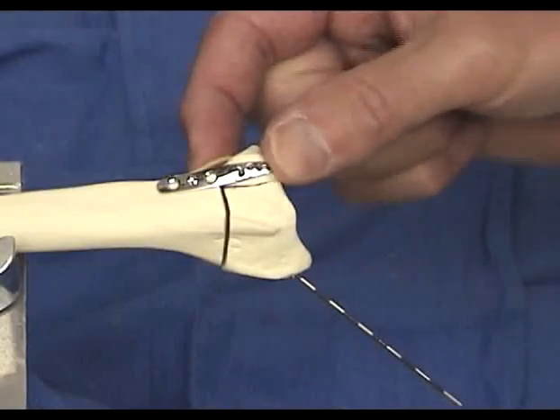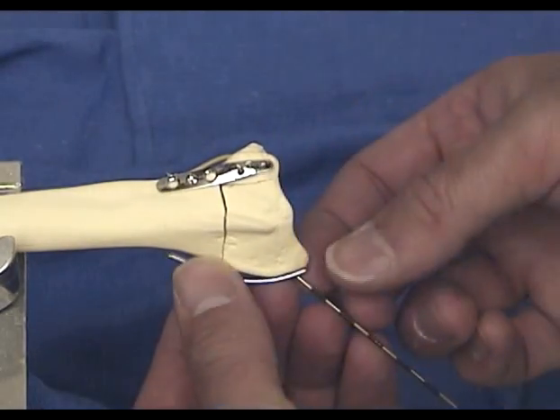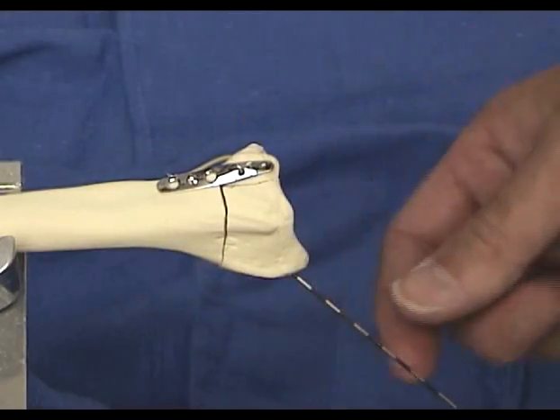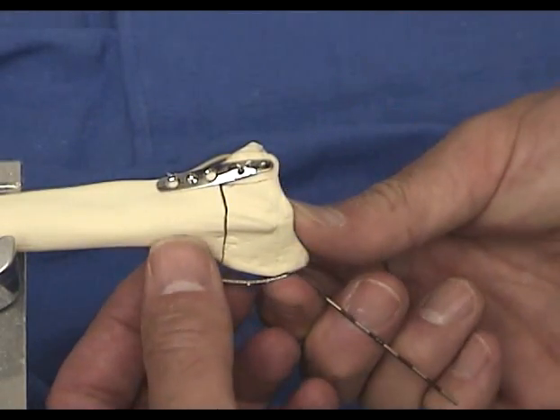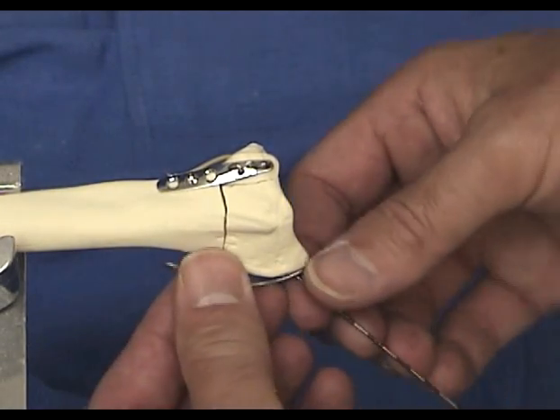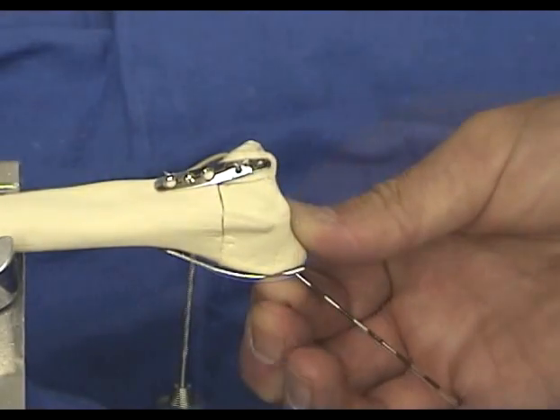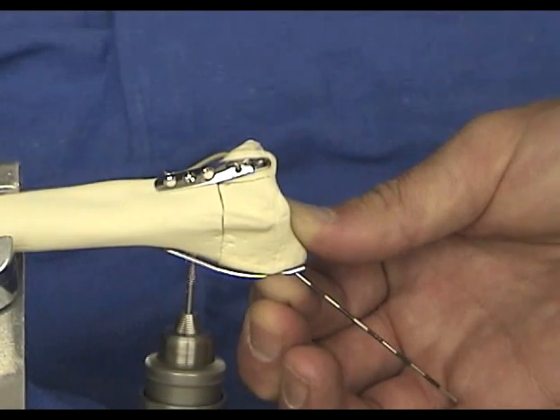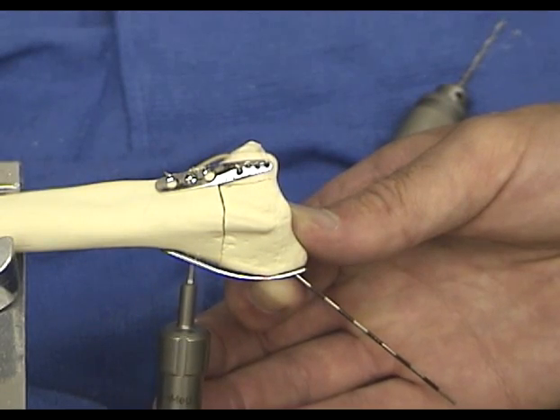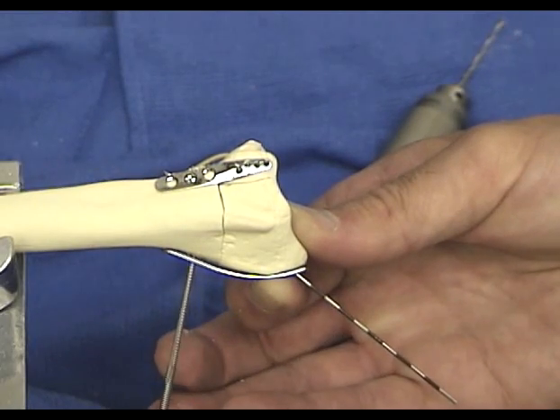Here you can appreciate the stability the ulnar pin plate adds compared to a simple pin. The radial pin plate is applied next. Normally, the middle of this plate sits off the radius by a millimeter or two. If excessive space is present between the radial pin plate and the bone, it usually indicates that the plate is too far proximal and should be moved to a pin hole that allows a more distal position. The plate is pulled proximally and secured initially with a single bone screw, preferably placed in one of the more distal holes.